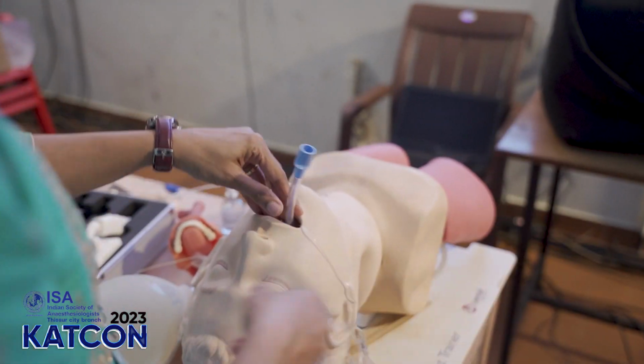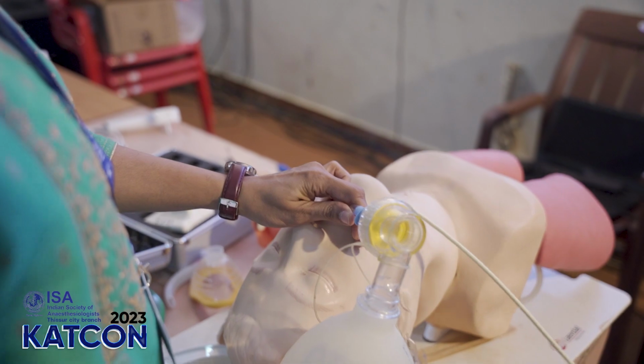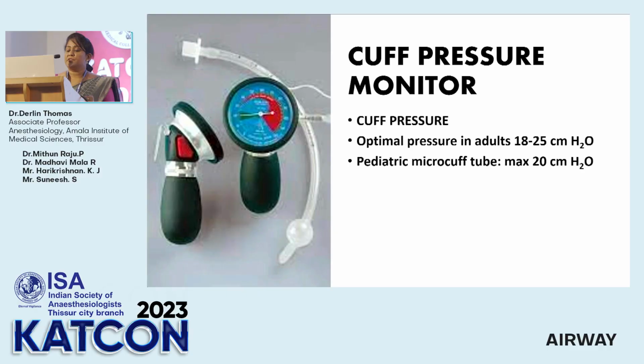You confirm the intubation by auscultation or whatever technique is used. This is a cuff pressure monitor in order to measure the cuff pressure. So the optimal pressure in adults is between 18 to 25 centimeters of water, while in the pediatric microcuff tube, the maximum we can inflate is at around 20 centimeters of water.